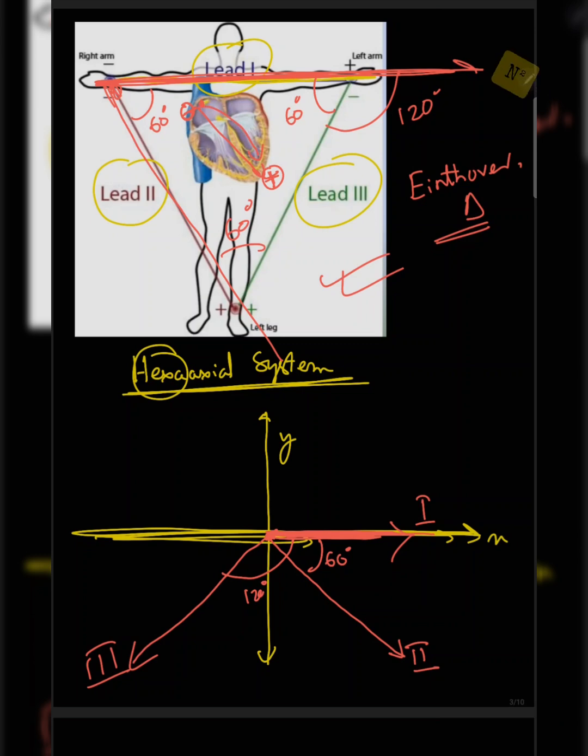So taking this concept in reference, we always will get to see all the graphical representation of negative markings or negative values above the 0 degree, and all the positive values will be given below the 0 degree or horizontal axis.